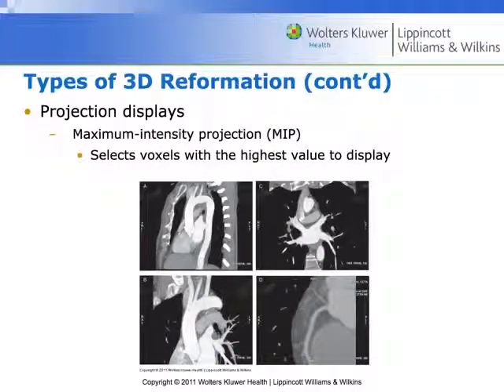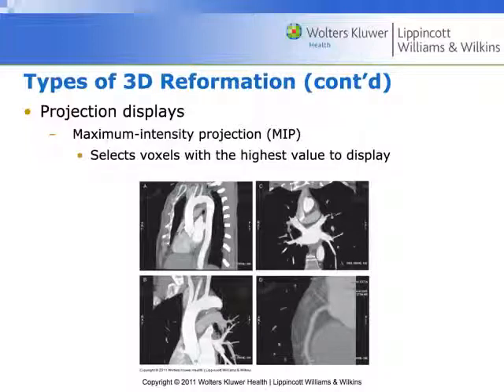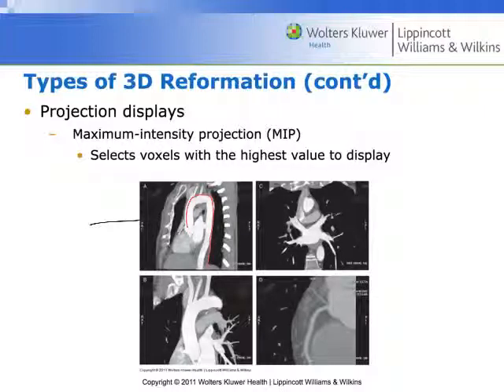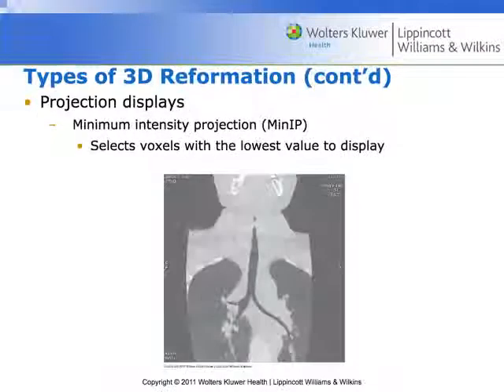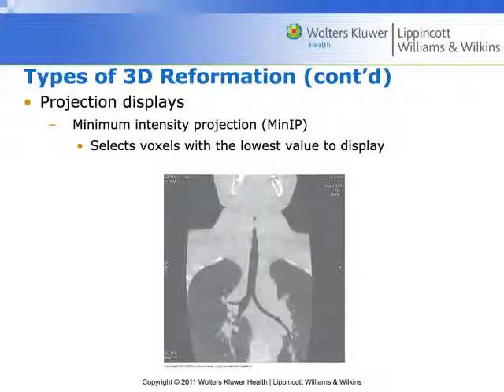MIPs — maximum intensity projections — are an interesting way of thinking about three-dimensional data. The computer has gone through and selected the voxels with the highest value to display throughout the 3D volume. For example, we have clear views of the aorta on these images, including an oblique view showing the entire aorta in a single view as a MIP. MinIPs — minimum intensity projections — are largely only used when viewing the lungs or the trachea, and now it selects the voxels with the lowest value to display, so we can clearly see the trachea and both lungs.